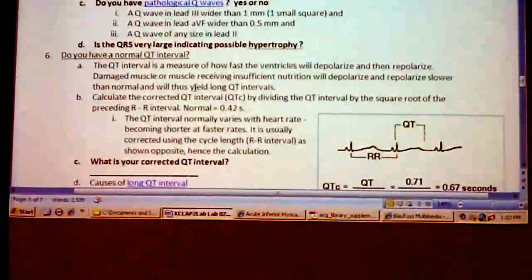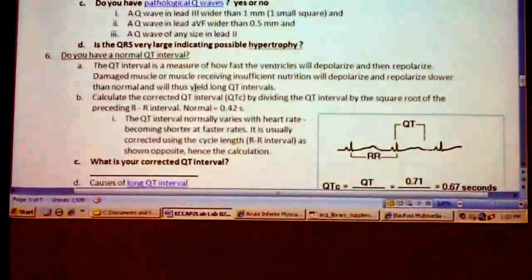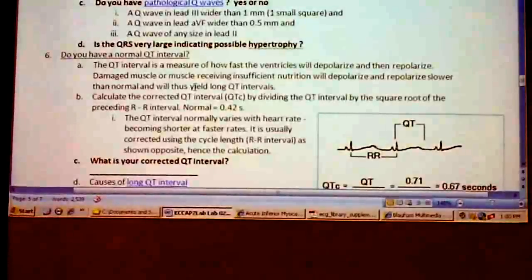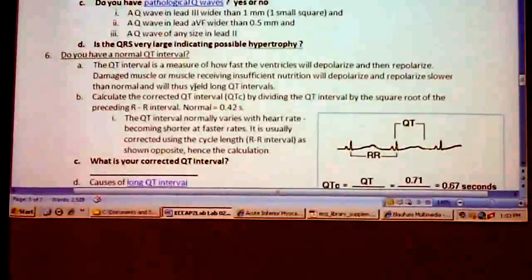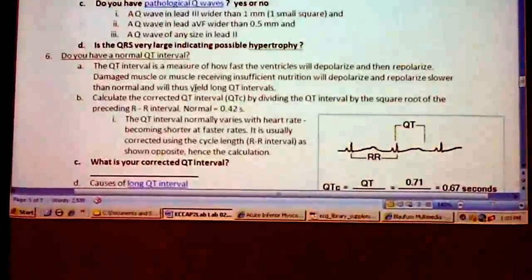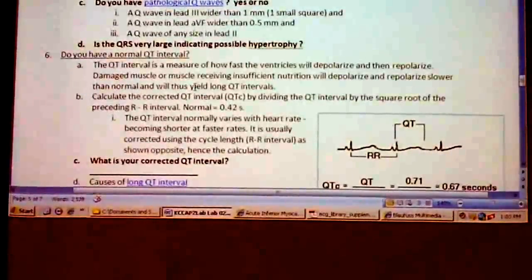The next one we're going to do is QT interval. To be honest, the next two are the ones that I think, there's 3 that are fair game on the practical because I think they're important. And again, I'm just trying to encourage you to not necessarily learn ECG, but at least be able to put together the puzzles so that you can have the confidence that you can figure out anything, I suppose.